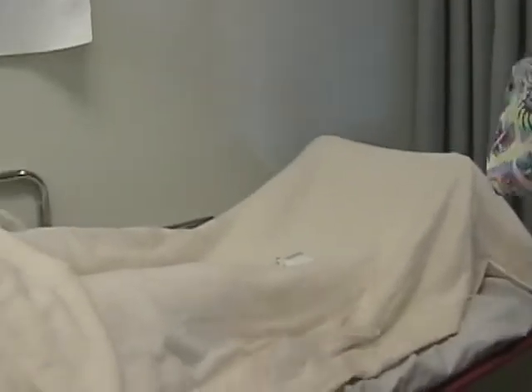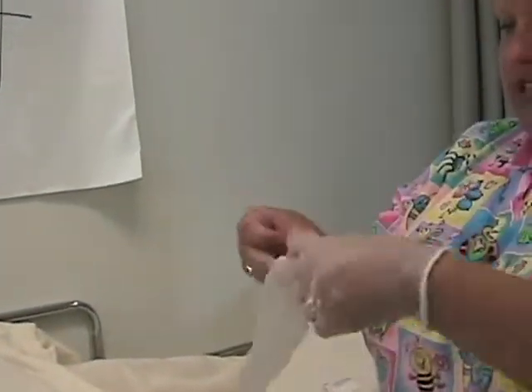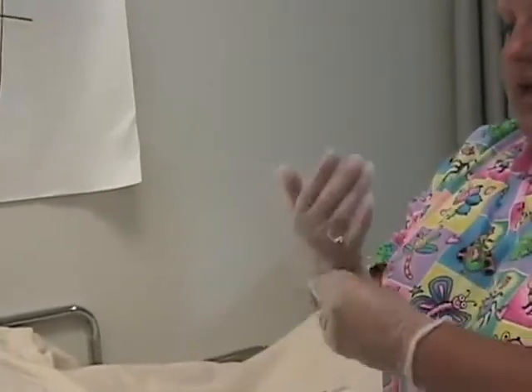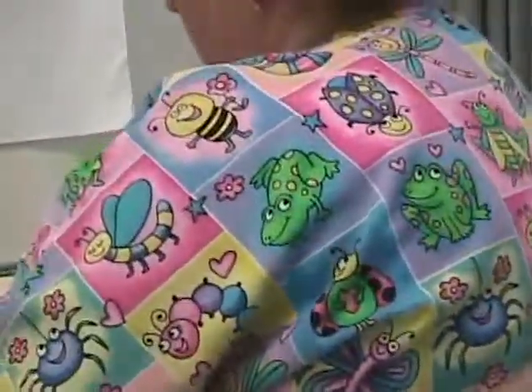So we go ahead, and I already performed hand hygiene. I used the hand sanitizer as I entered the room. I go ahead and put on, again, my gloves that fit, because we would not want to give an injection with gloves that are too big or too small. And so here we go. Go ahead and put our clean gloves on. We find our site, expose the skin.